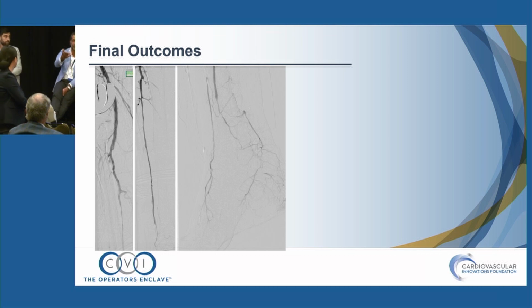But usually what I'll do is the balloon. The reason I do that is because inevitably if I just do external compression, at the end of the case you'll do a little angiogram and it'll be a little hazy. Usually it's just a little spasm, but then you get stressed about it, and you end up doing balloon anyway. So I just do balloon for everybody. Same thing, like 3-4 minutes. Usually I'll go up until I see cessation of blood flow, then I'll stop and sit around, we'll have some coffee, we'll hang out, we'll sing some Indian Bollywood songs.